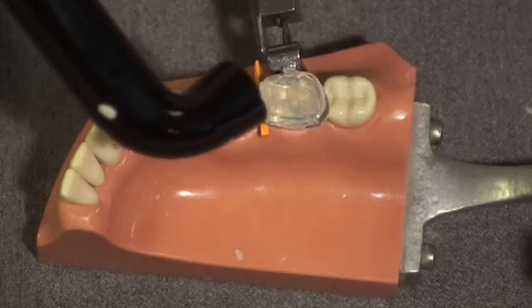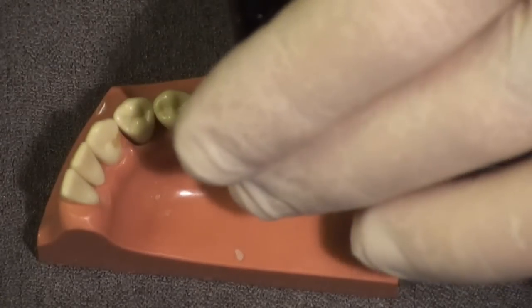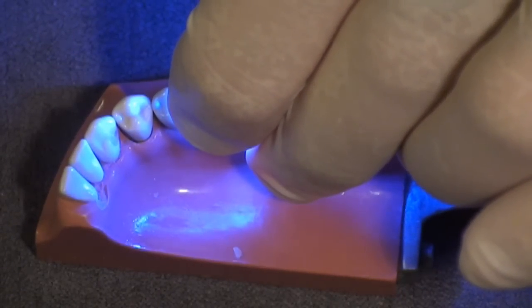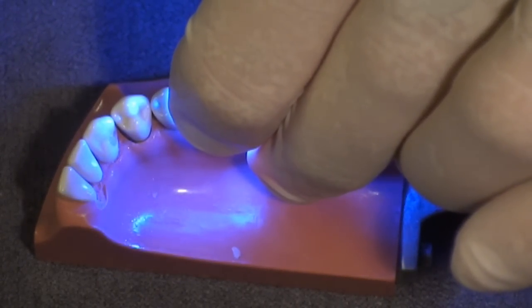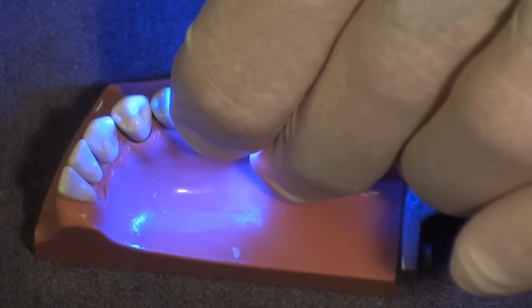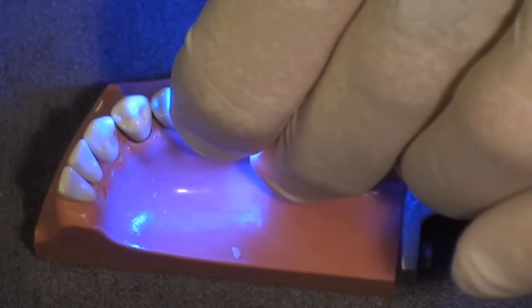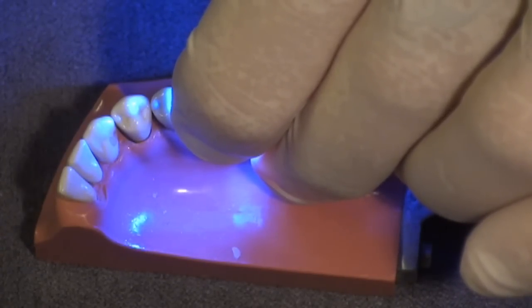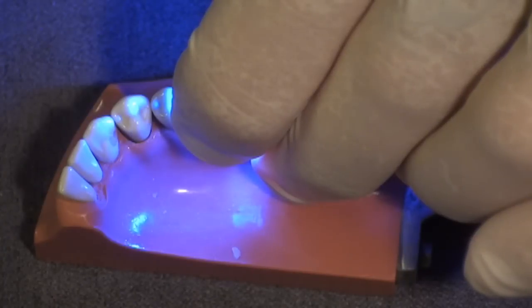Now I take the flat end of the light curing bundle, match it up with the flat surface created by the mylar strip earlier, and maintain pressure on this while I cure through it — curing and setting the composite with the original anatomy, occlusion, and surface texture the patient was comfortable with, and without an air-inhibited layer.